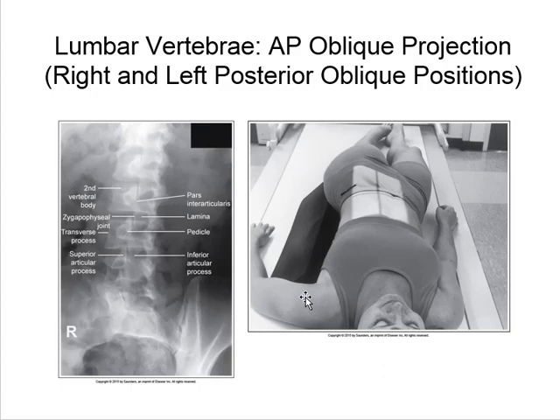So the obliquity for a T-spine is very steep. It's 60 to 70 degrees. So naturally, in a slow transition from T-spine to L-spine, the upper portion of the L-spine, the anatomy that we're interested in seeing, would be best visualized with a steeper oblique.